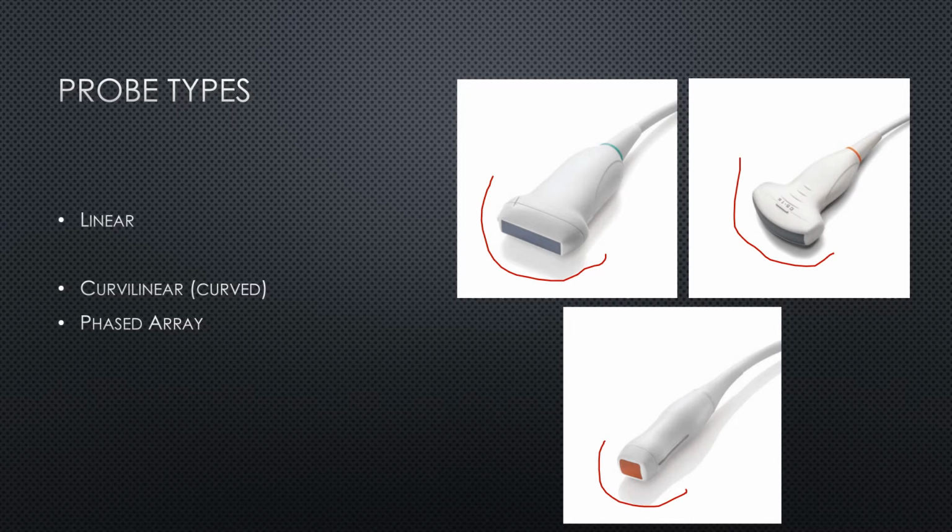We do have an endocavitary probe at our facility. We don't currently have a TEE probe. That may change in the future, but for now we're going to focus on these three that you're going to run into no matter where you are.